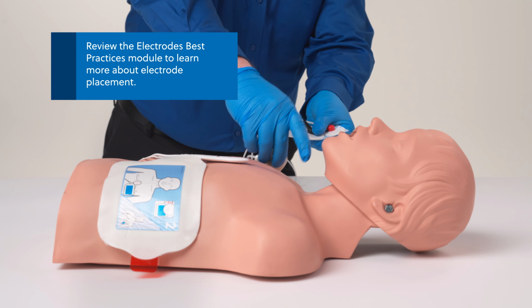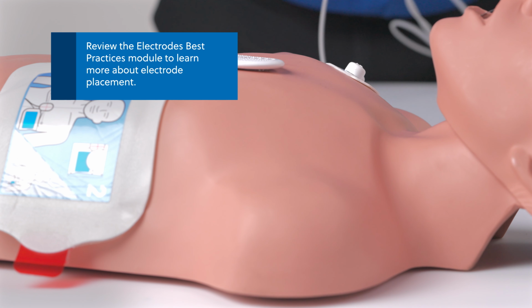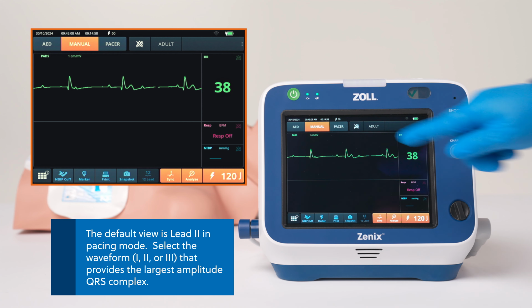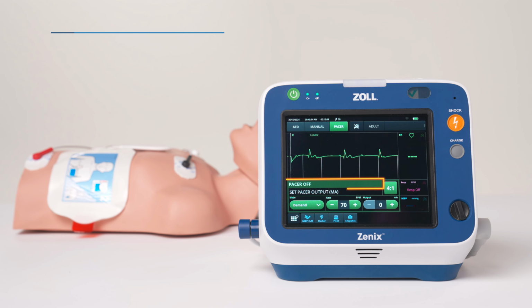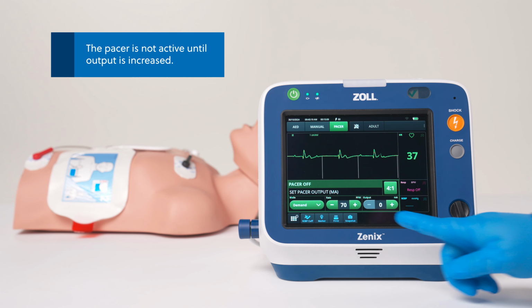To initiate external pacing, place both the 3-lead ECG and therapy electrodes on the patient and ensure they are connected to the device. Select Pacer mode. The Pacer dashboard appears at the bottom of the screen. Note, the Pacer is initially off. Use the plus and minus keys to adjust the heart rate.